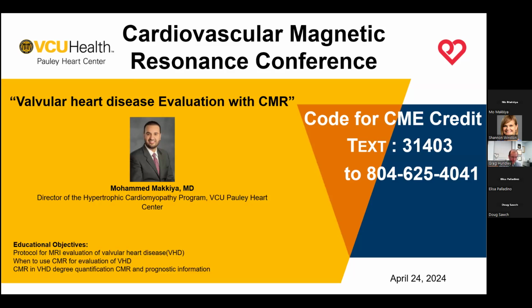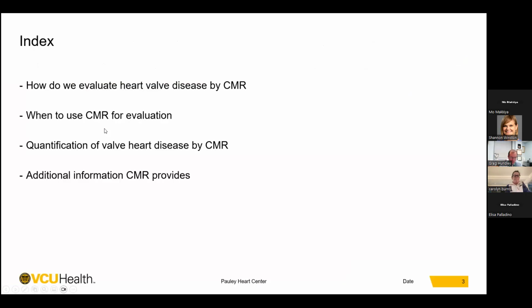And today, a little bit on time constraint. I have to go to a remote clinic, and I'm going to talk about valvular heart disease and evaluation utilizing CMR for that. I have no disclosure for this talk. Today we're going to talk about how we evaluate heart diseases by CMR, when to use the CMR for evaluation, quantification of heart disease by CMR, and additional information that the CMR provides when we do that.